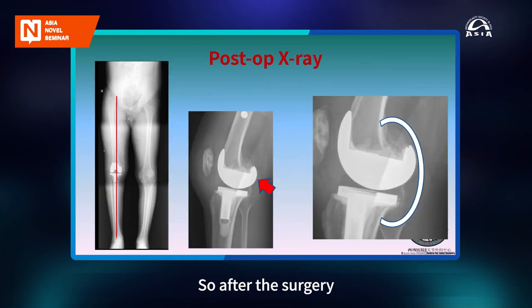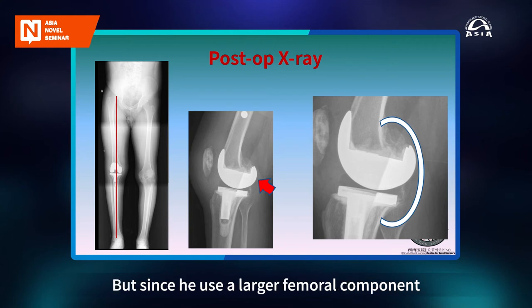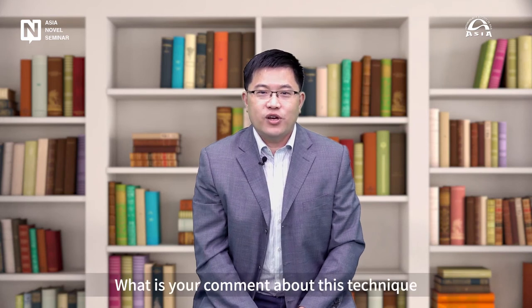So after the surgery, you can see that the patient has an okay alignment. But since he used a larger femoral component, there's a stretching of the posterior capsule. So the purpose of this technique is to try to get full extension and correct the flexion deformity. But with a larger femoral component, maybe it is another difficulty in correcting the flexion deformity. So what do you think, what's your comment about this technique?